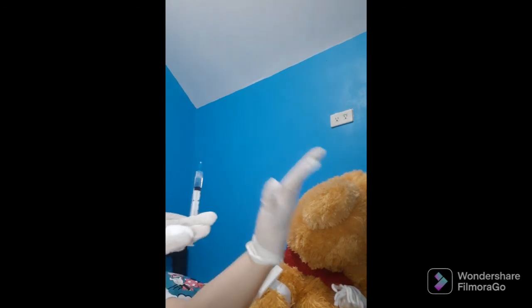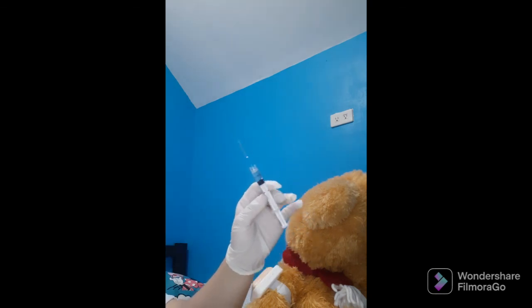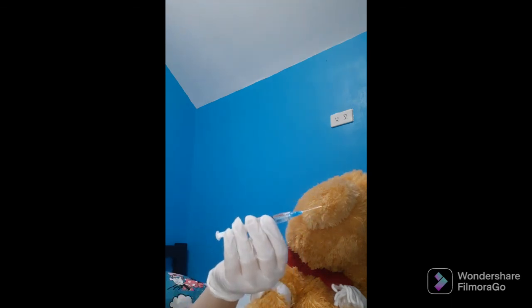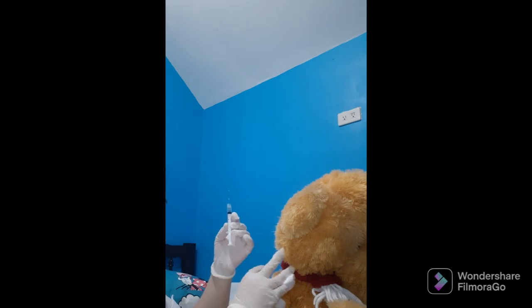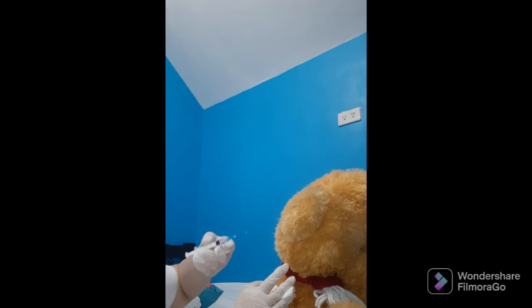And then next is we need to inject na yung ating medication. We need to grasp yung ating syringe with my dominant hand, holding it between the thumb and forefinger, with palm facing to the side or upward for a 45-degree angle insertion, or with the palm downward pagka naman 90-degree angle insertion. And we need to prepare to inject. Using my non-dominant hand, ipipinch ko lang po. And then, gagamit po tayo ng 45-degree angle.